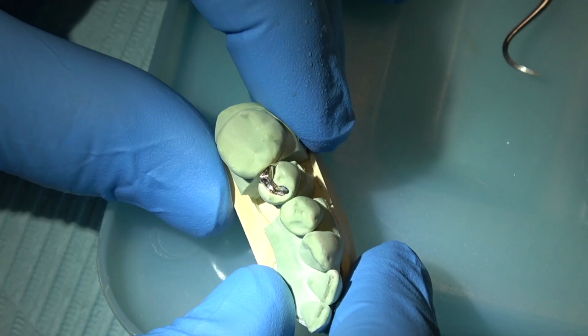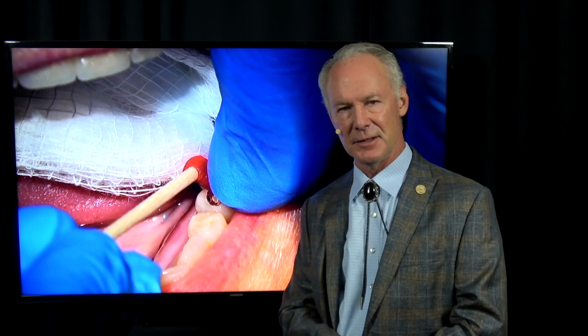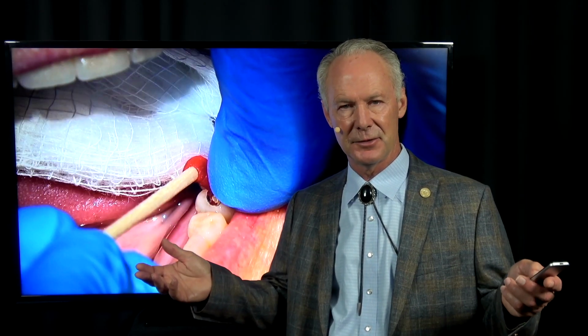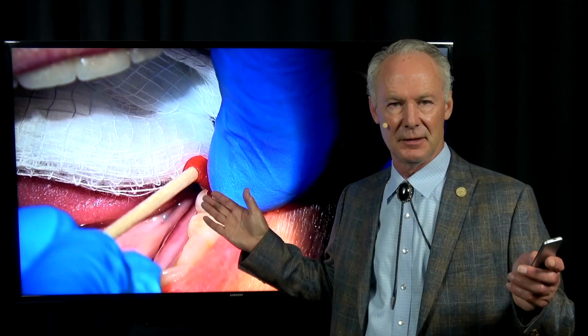There's my inlay. Now, I have patients in my practice that have had inlays and onlays and gold crowns on their teeth for 75 years. I mean, it's like I say, it's like a shot put or a flint rock. They're just pretty much indestructible, and the margins are just perfect. So if these are cemented with resin cement, unless they're in an accident, they should have them for the rest of their life.